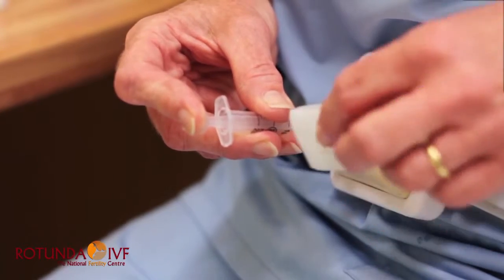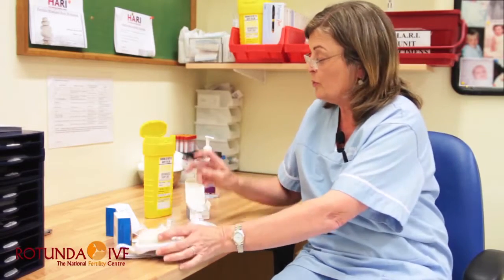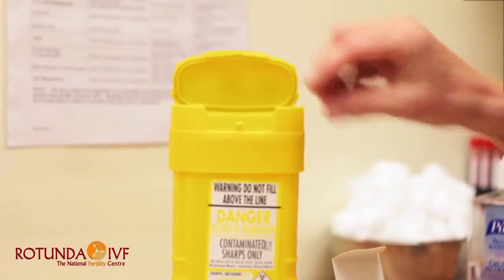Take your alcohol swab, push the skin back and withdraw the needle. You have now given your Pregnyl injection. Place all your used syringes and needles into the sharps bin provided.